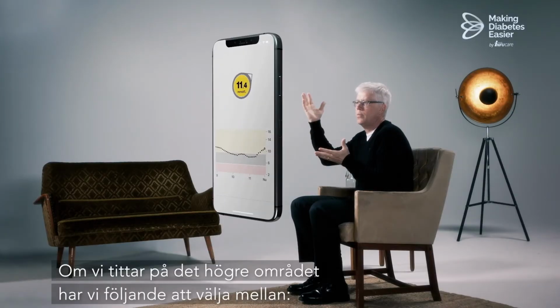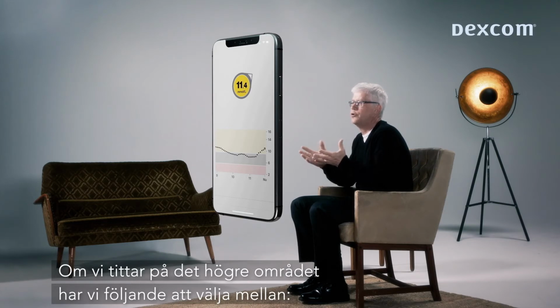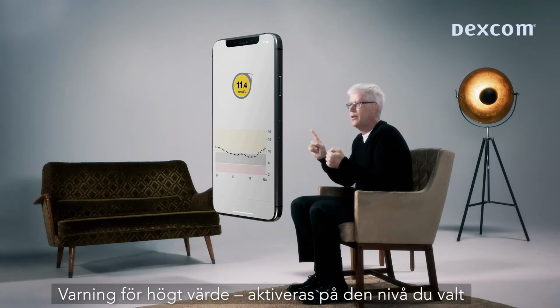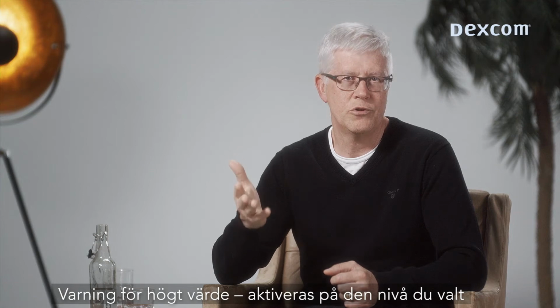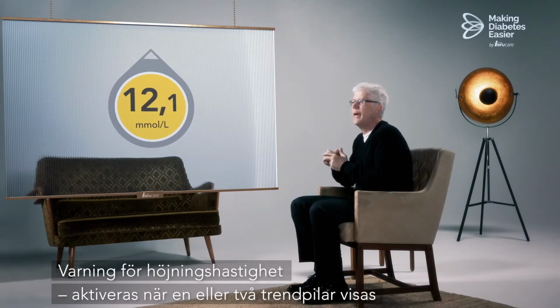If instead we look at a higher range, we have the corresponding alerts to choose from. High alert, activated at a chosen level by you. Rate of rise alert, activated when 1 or 2 trend arrows are present.